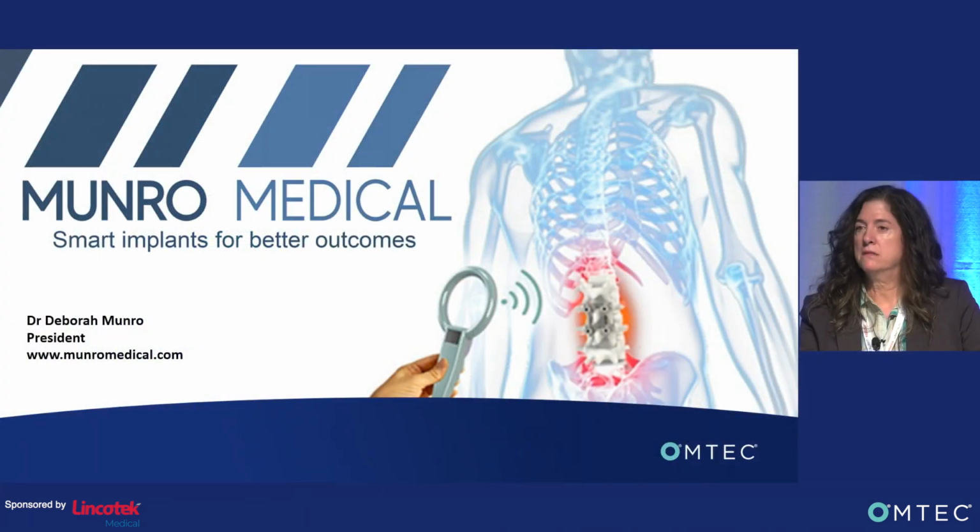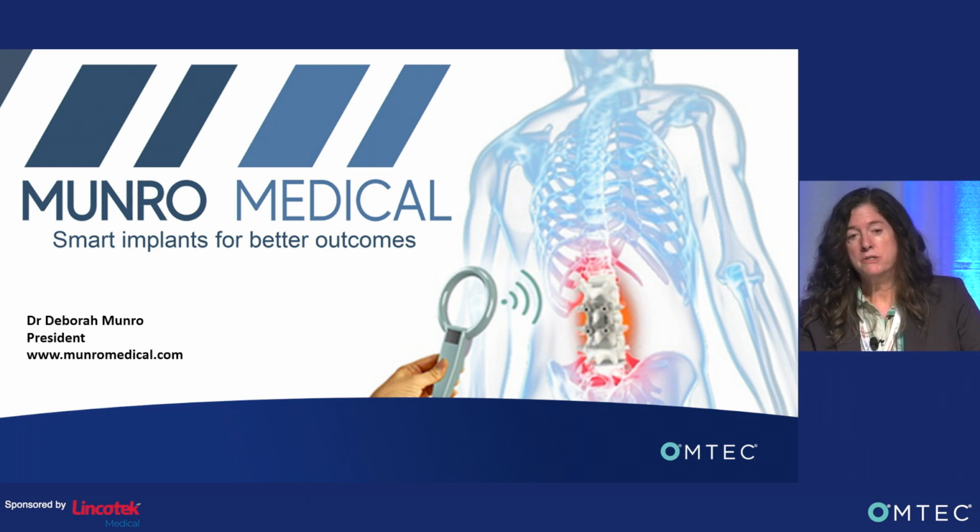All right, so I developed a smart implant technology, and I'm in the process of spinning out a company from my university, and it is based on spinal fusion and trying to monitor the progress of spinal fusion as it heals.